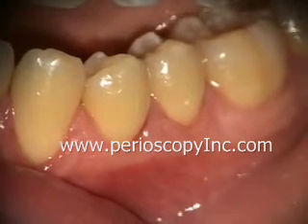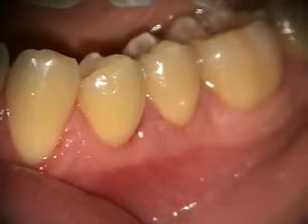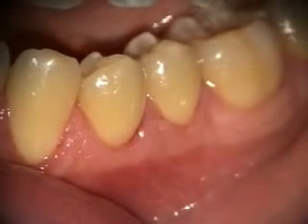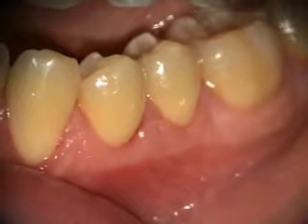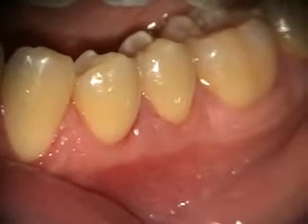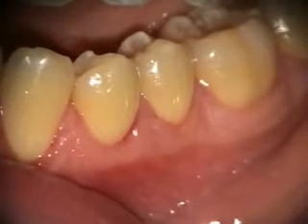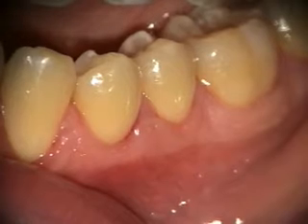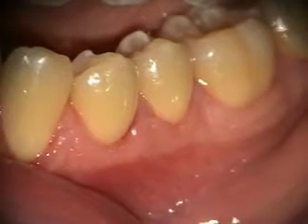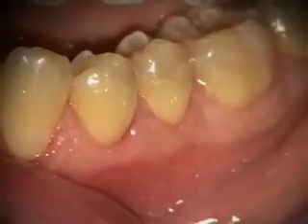We're going to be seeing him in four months to follow his perio, but the graft looks great — it looks like nothing ever happened. You can see in the interproximal papilla area between 20 and 21 and 22, there's a little bit of a line where we made our initial incision and coronally positioned that tissue. We'll see how that remodels in the upcoming months.